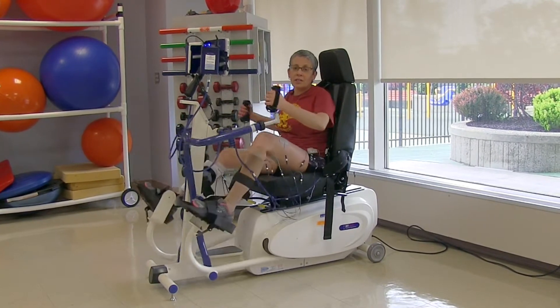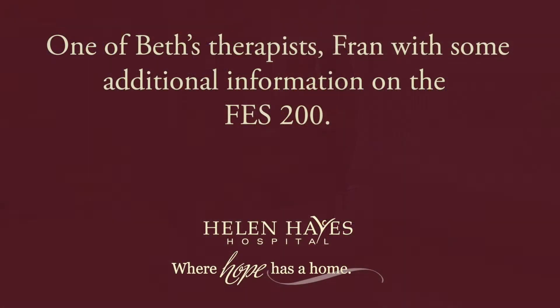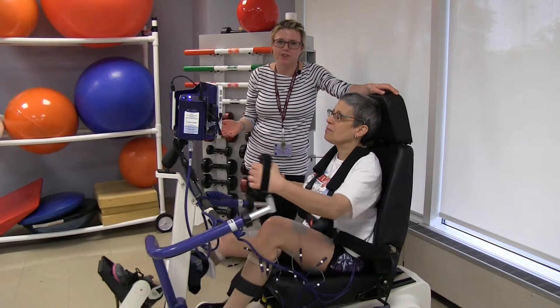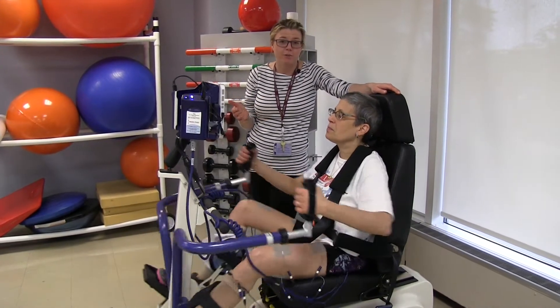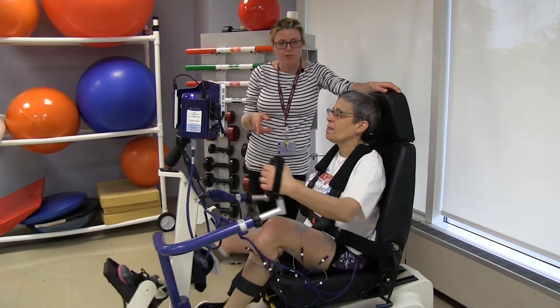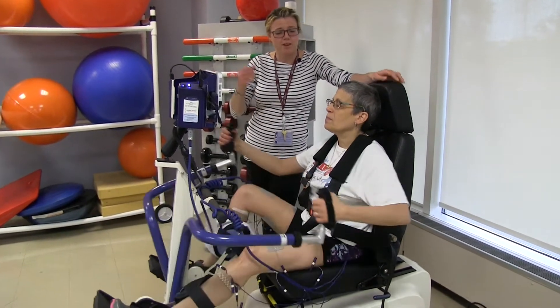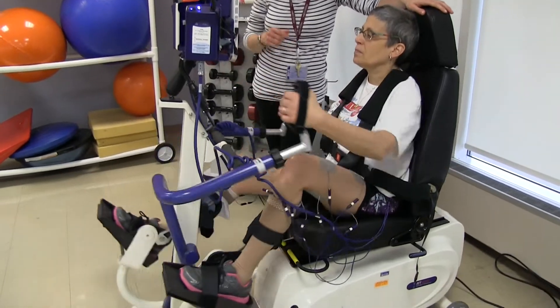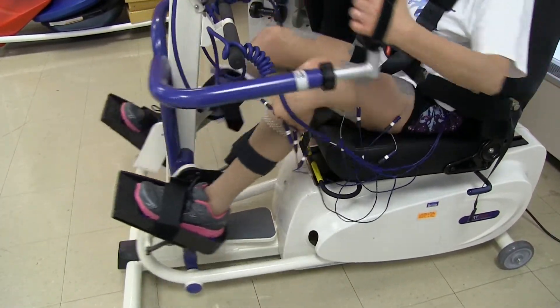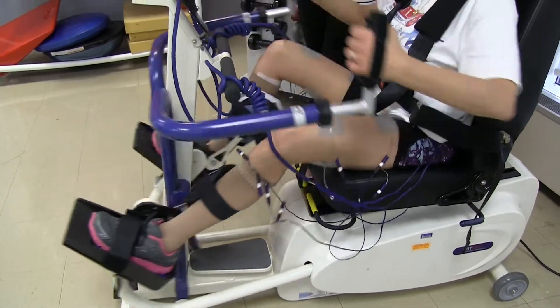I'm thrilled to be using it here at Helen Hayes. Beth is currently using our FES-200 system. With this system, it allows patients to use simultaneously the arms and the legs. Right now, Beth is currently only using the leg stim as she has upper extremity functioning, but with this device we can set up for the shoulder, we can set up for the back. It just allows for a more encompassing and full body workout.